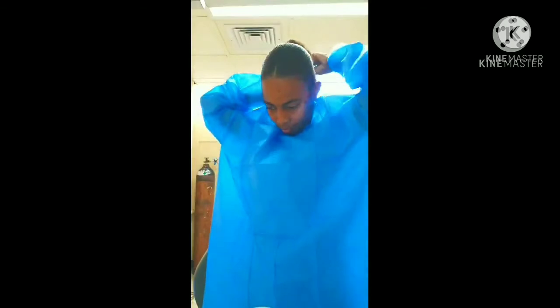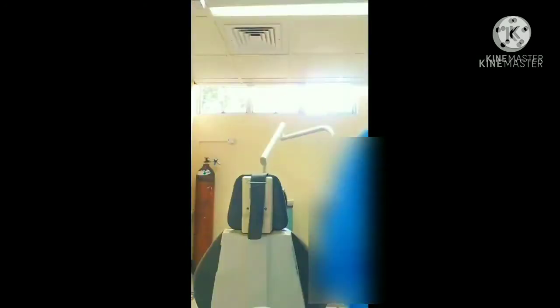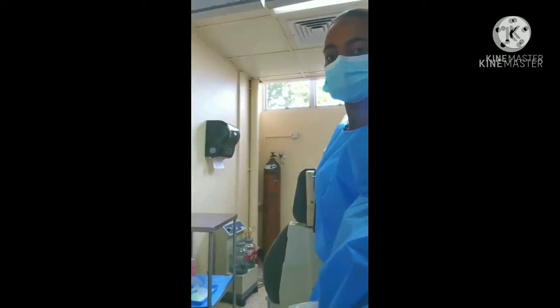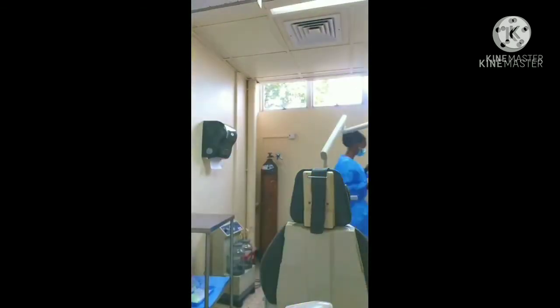So to start off my morning, what I'll do is wash my hands. I didn't get a chance to video that part, but I wash my hands and get my PPE ready. So I'm putting on my gown now. Then I'll put on my gloves. So I'm going to prepare the operatory for the first patient of the morning. There are seven operatories, and with the help of my colleagues, there are quite a few of us that work in here, and each of us does our part in getting the first patient on the road.